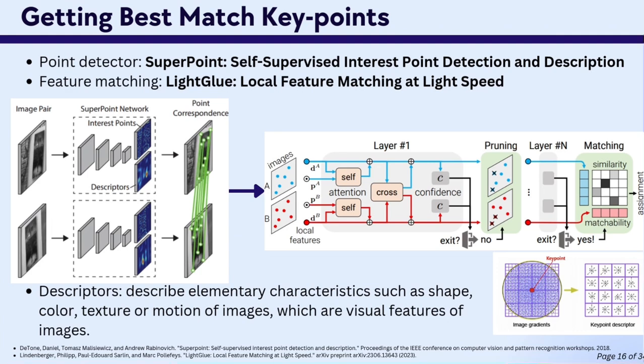It leverages SuperPoint, SIFT or DISK to extract local features from both images, each comprising a descriptor and a key point.